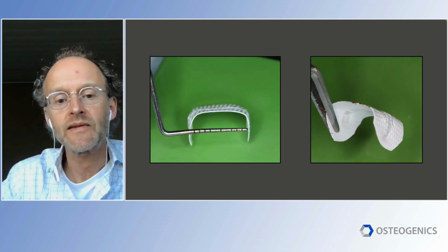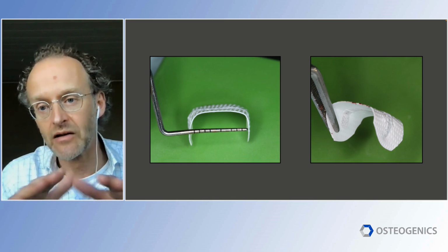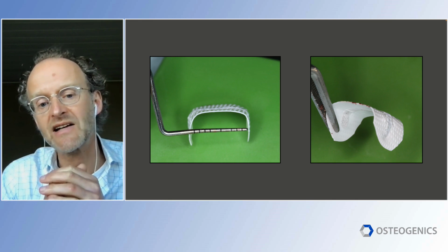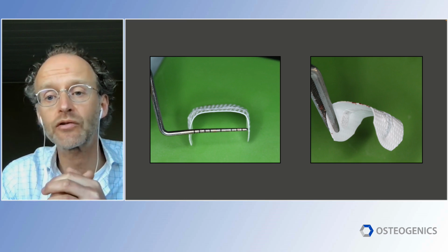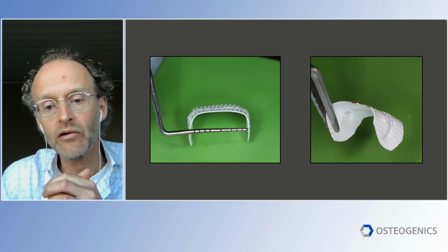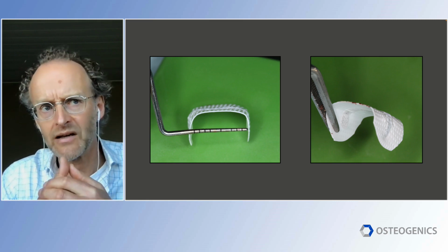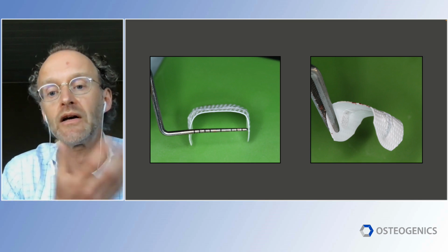But take care, if you use the titanium reinforced membrane, which we liked, as I said, it's easier to get it under the papilla, because the papilla really should cover the edges. Make sure that you bend it in a really U-form square size and also mimic the sizes of the ridge which you want to restore and which it was originally. You can't overbuild too much outside the original form. And on the right, you see that you really make the edges deep enough that they really pass the existing borders. So make it preferably longer, so that it is really stuck under the tissues quite deep, to have this stability and to minimize the chance that it will exfoliate.